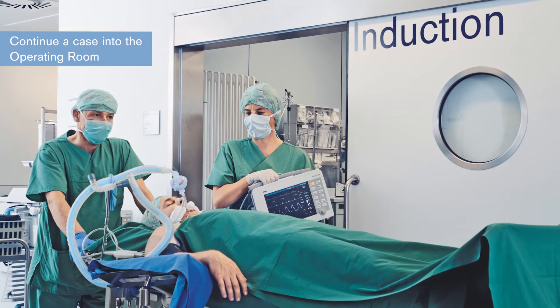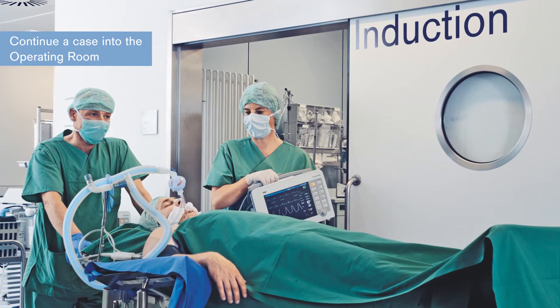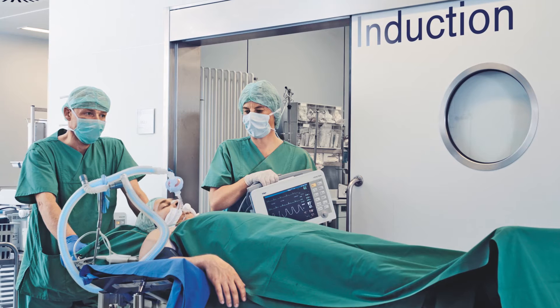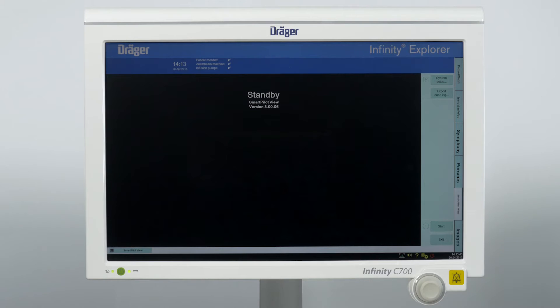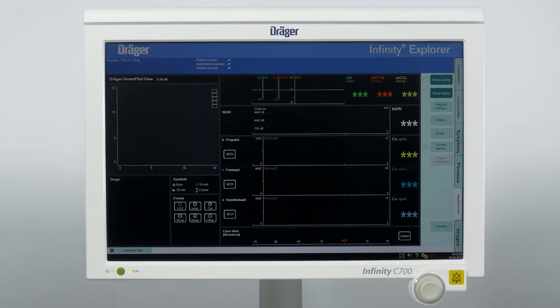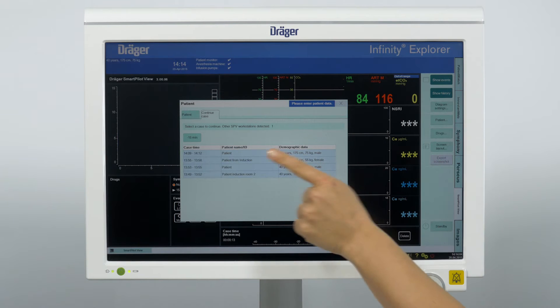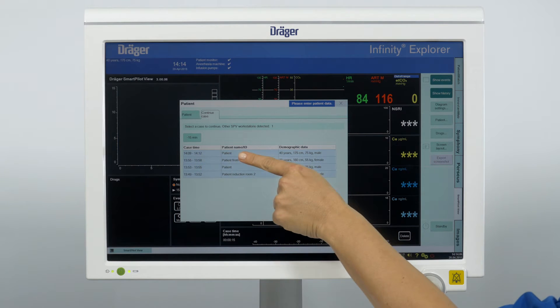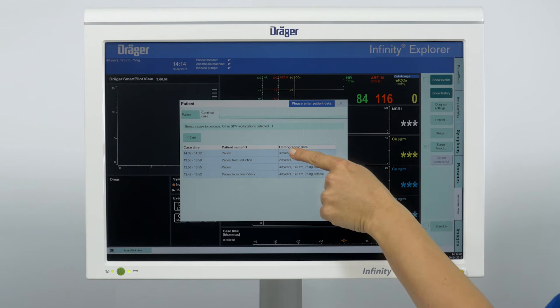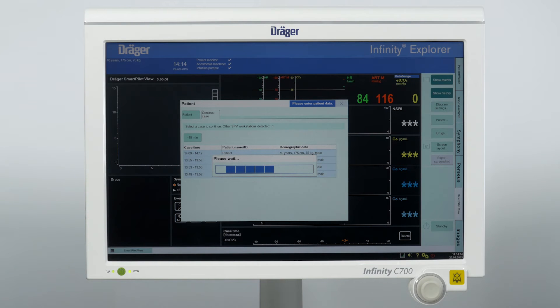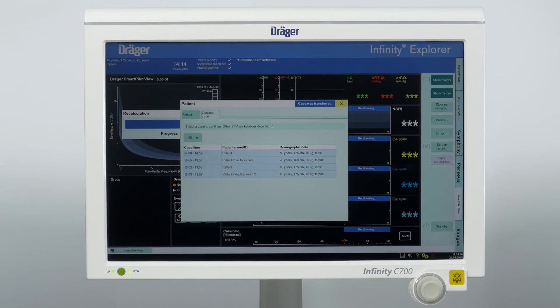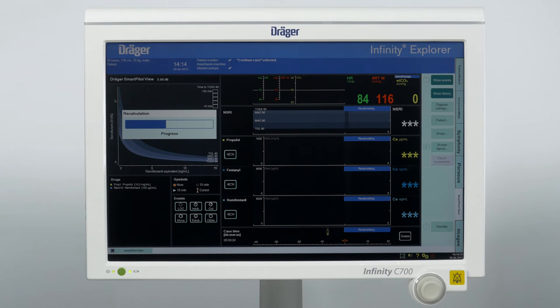If you work with induction rooms, you can continue a case in the main operating room. Press the standby button to stop SmartPilotView in the induction room. In the main operating room, switch the second SmartPilotView from standby mode to operation mode by pressing the start button. A patient dialog window will appear. Select 'Continue Case' and you will see a list of cases. Select the case according to your patient and confirm to continue. Now the second SmartPilotView is active and will continue to display the calculated anesthesia level in the main operating room as a continued case after the induction room.